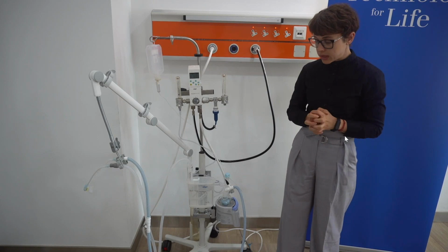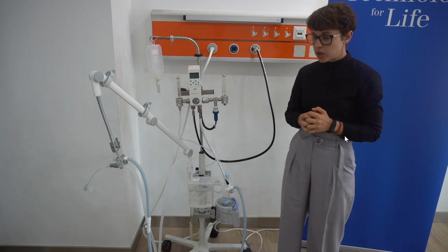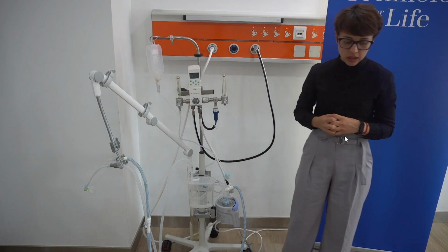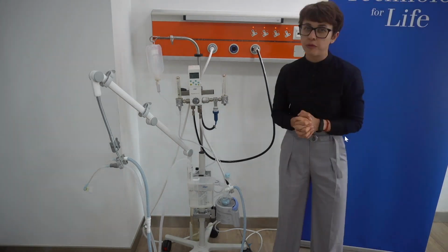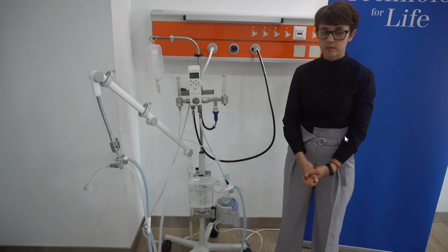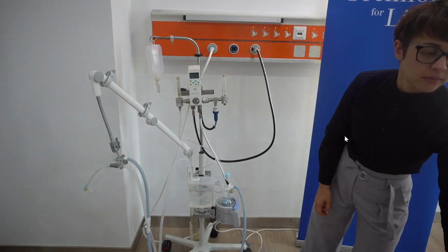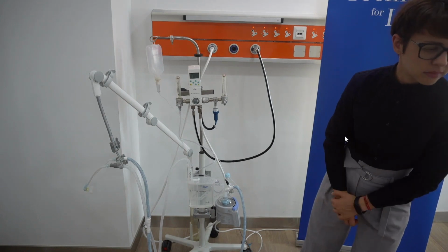But in terms of the use of a bacterial filter during CPAP therapy, I don't think it's a common practice, to be honest. Linda, in your unit, have you used bacterial filters? No, not at all. In actual fact, there is a lot of research going on regarding the appropriateness of a filter for short term.